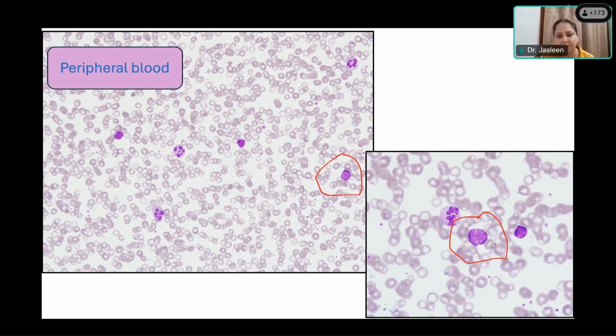These reactive lymphocytes are reacting to some condition in the body, and as a reaction, they are trying to produce a lot of proteins, right? Because of this production of proteins, the nucleus becomes slightly opened up. Your nucleoli can also be seen because protein functioning activity is increased. That is why your cytoplasm becomes blue, because the blue cytoplasm has a lot of immunoglobulins that this cell is producing. So typically your reactive lymphocytes will be slightly larger in size and have slightly blue, abundant basophilic cytoplasm, right?